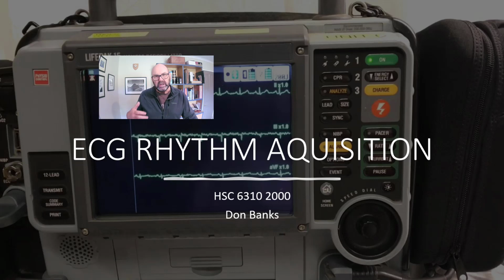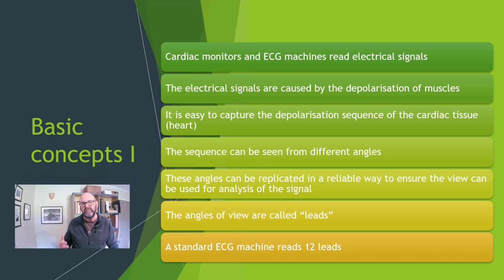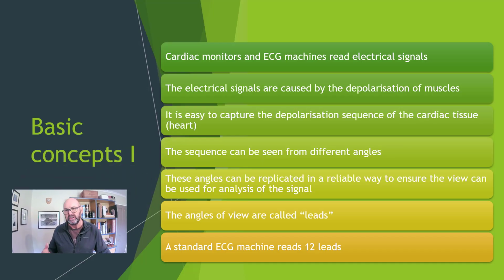Kia ora. Now, I know you've had to suffer through some of this information in the previous year's studies, so this presentation is just a quick recap on the basics of rhythm acquisition. We'll go on in class to talk more about specific rhythms. We'll briefly run through some of the basic concepts associated with cardiac ECG acquisition and the rhythms.